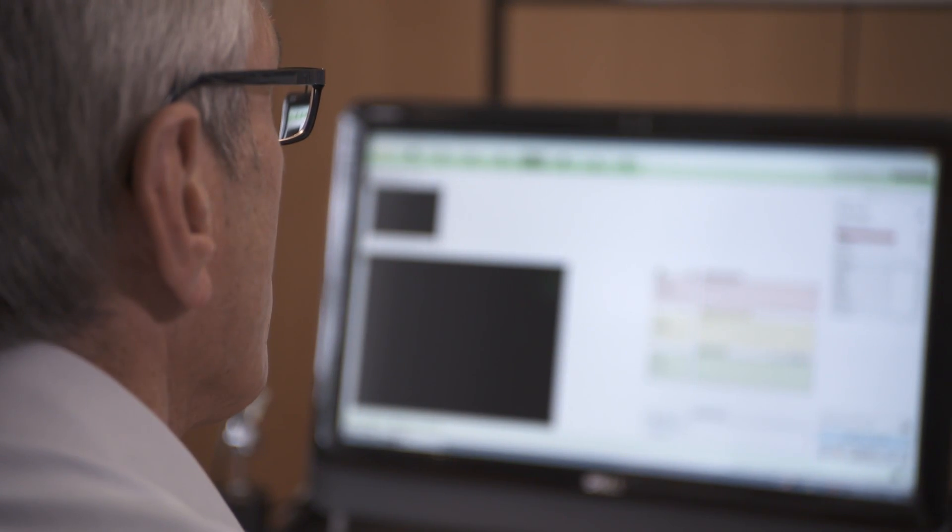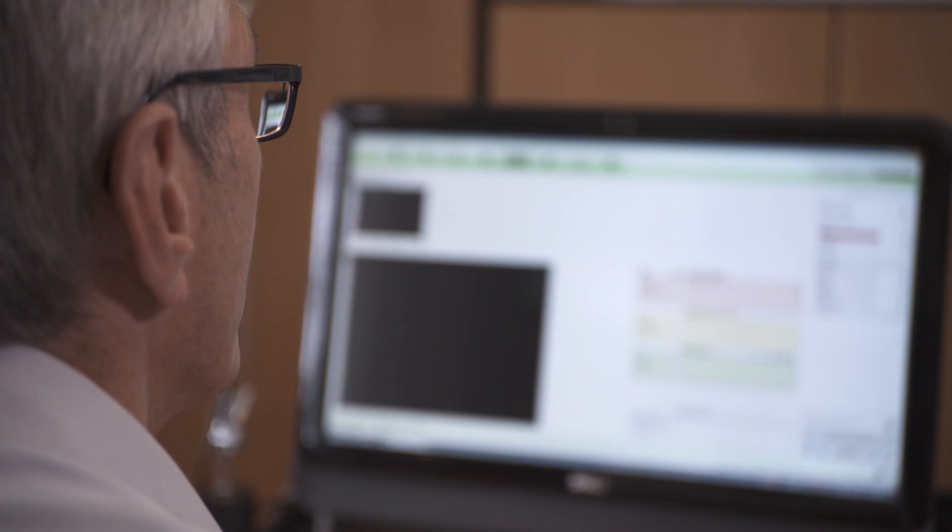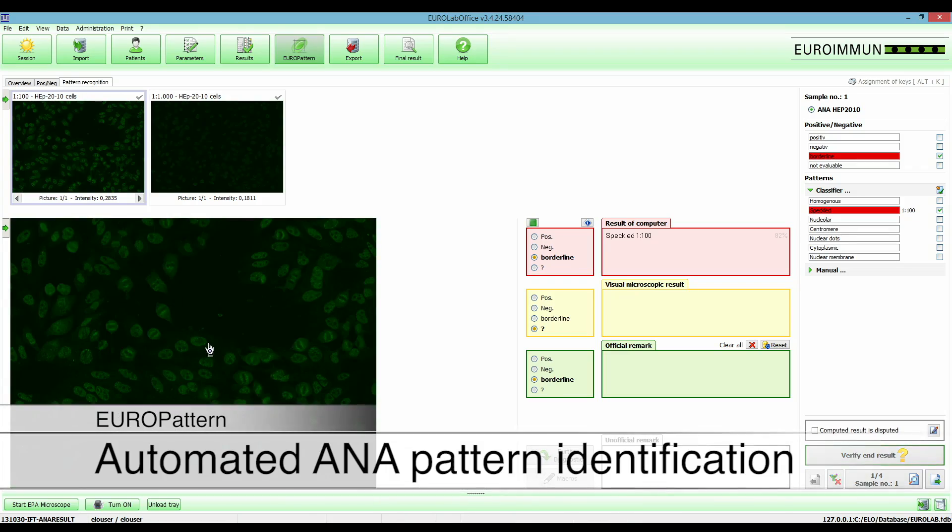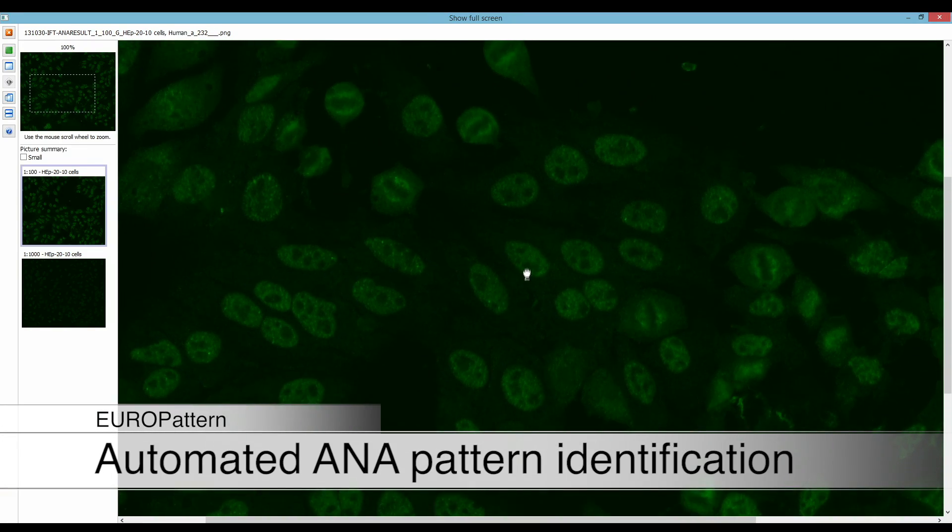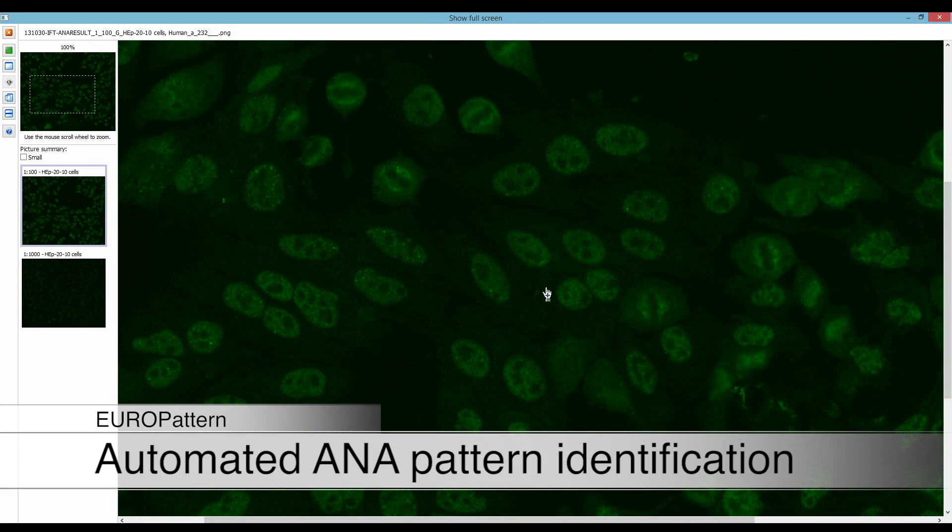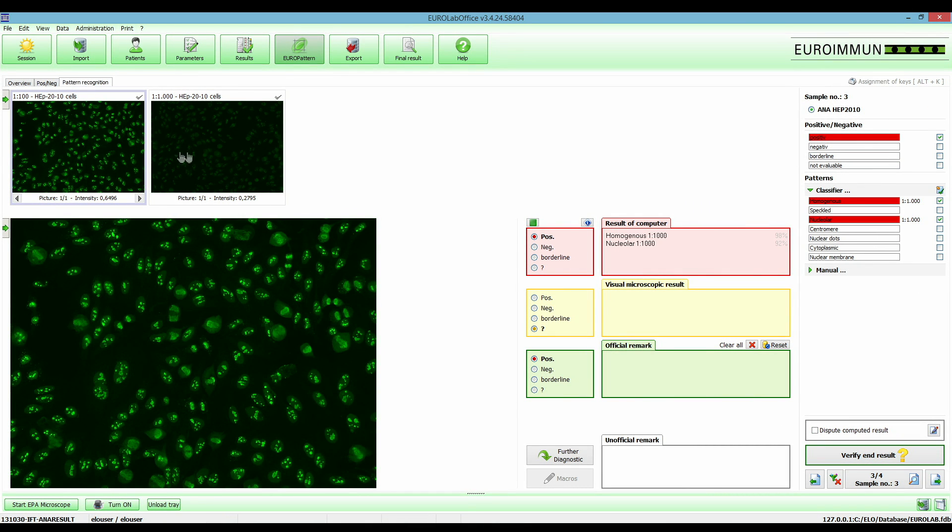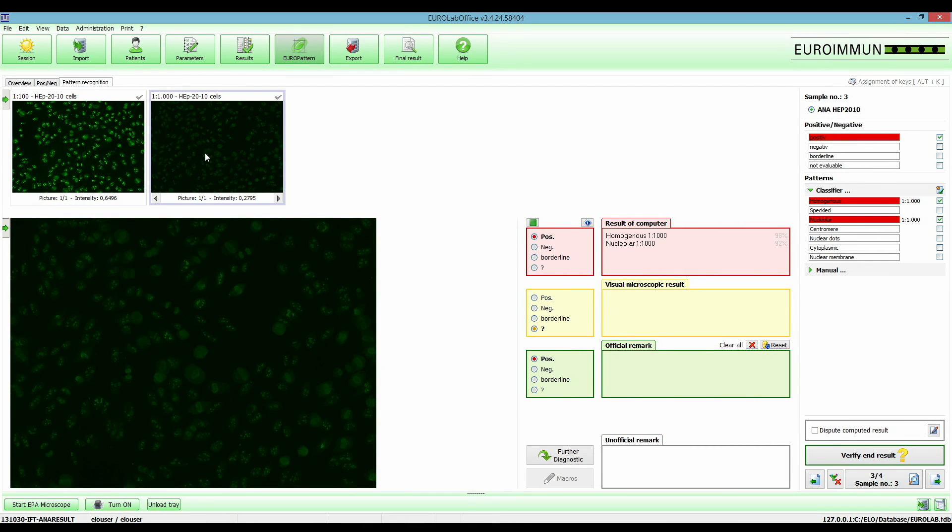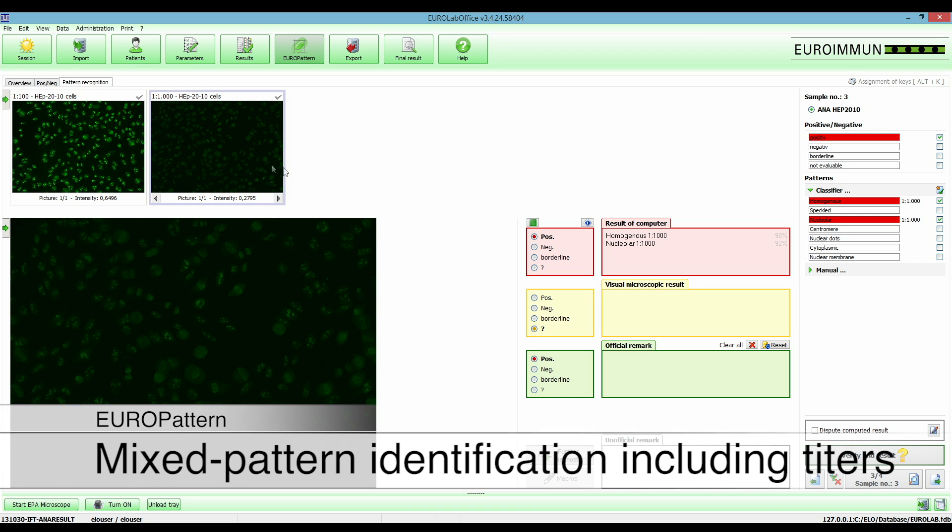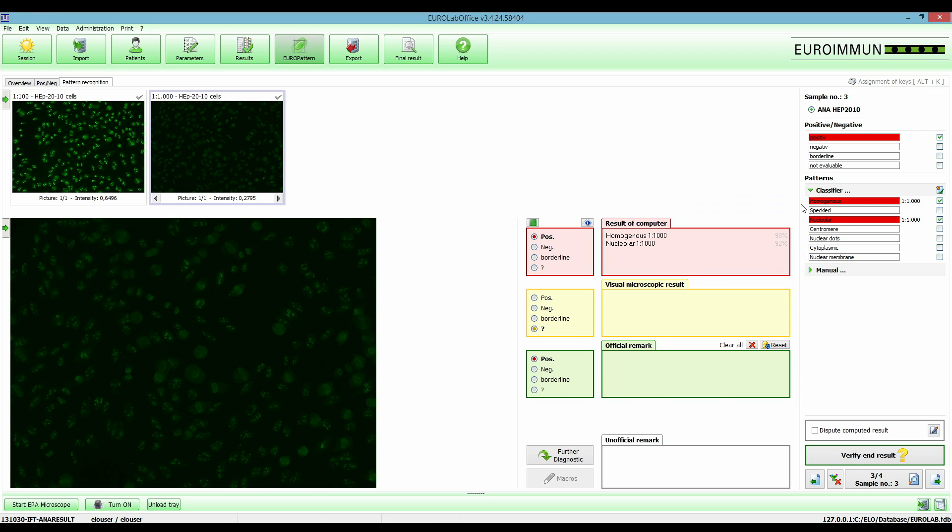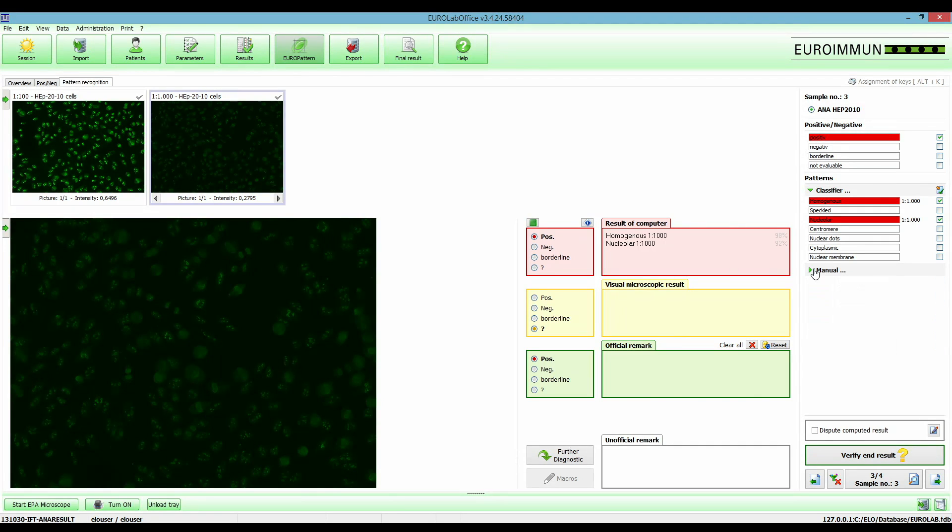For identification of the seven diagnostically relevant ANA patterns, 180 features of 115,000 images of real verified samples are compared. Also arbitrary pattern combinations are recognized including their confidence values and calculated titers. Results can be edited manually and customer specific patterns added.